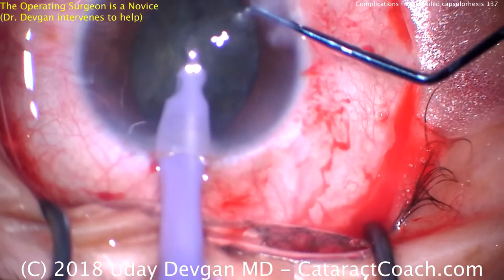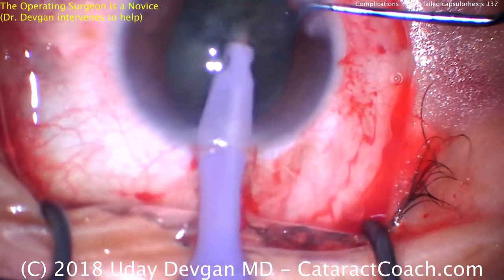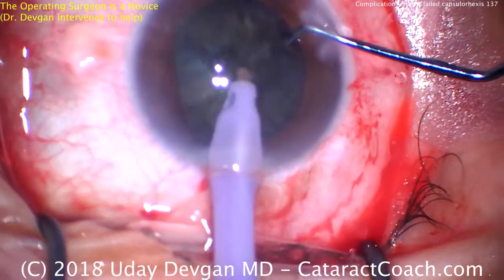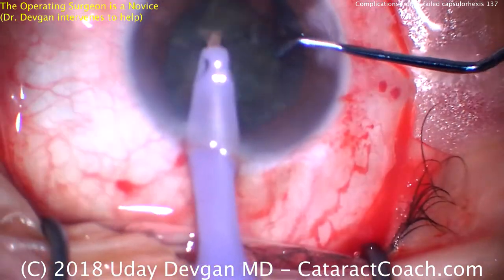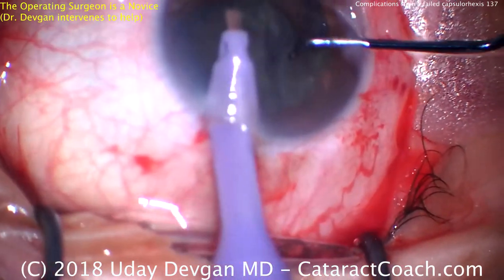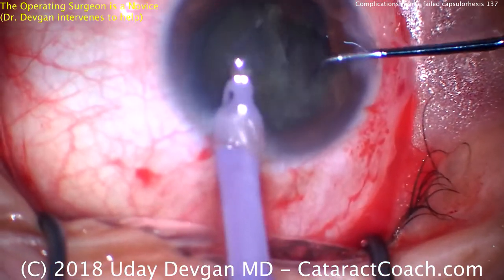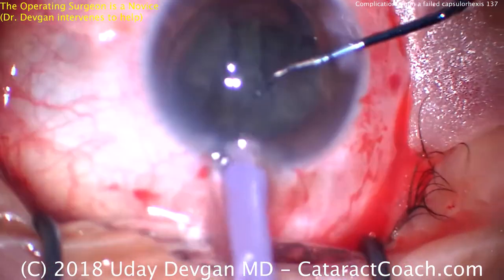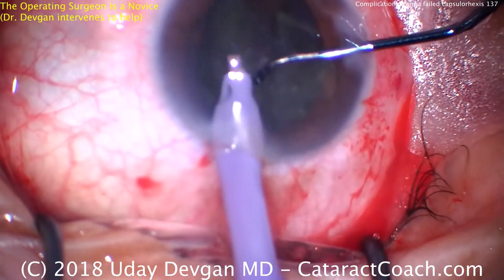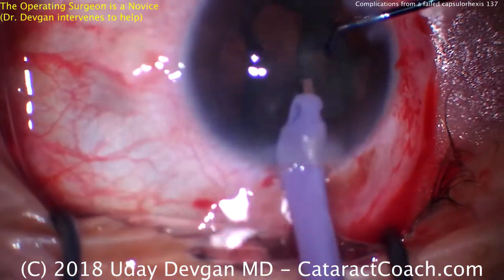When the novice surgeon puts in the phaco probe, I can be the chopper hand and help bring the pieces towards the phaco probe. Now you're seeing two surgeons operating. Straight ahead, coming from the bottom of the screen — which is the patient's superior position — that's the novice surgeon. To the right, the chopper, that's the professor. As we feed the nucleus into the phaco probe to emulsify, things are going okay, so we can still have a nice normal case here. We just have to be very careful.